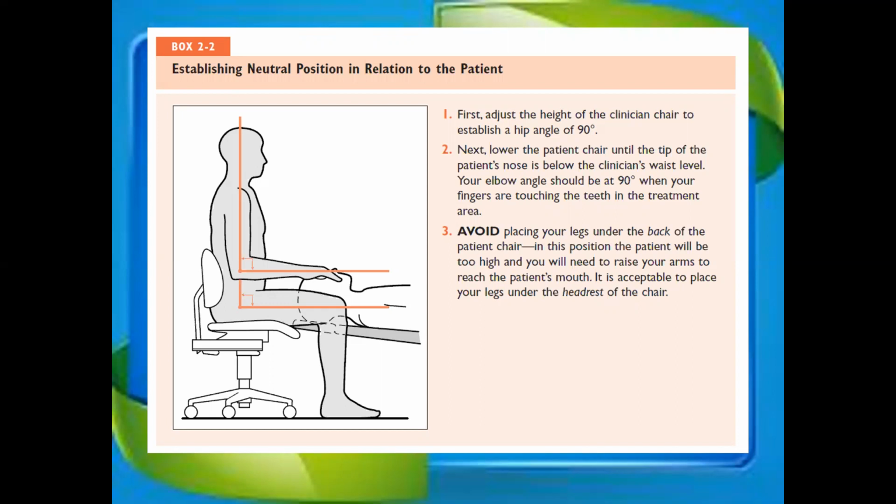And you should avoid placing the legs under the back of the patient chair. In this position, the patient will be too high and you will need to raise your arm to reach the patient's mouth. It is acceptable to place your legs under the headrest of the chair.